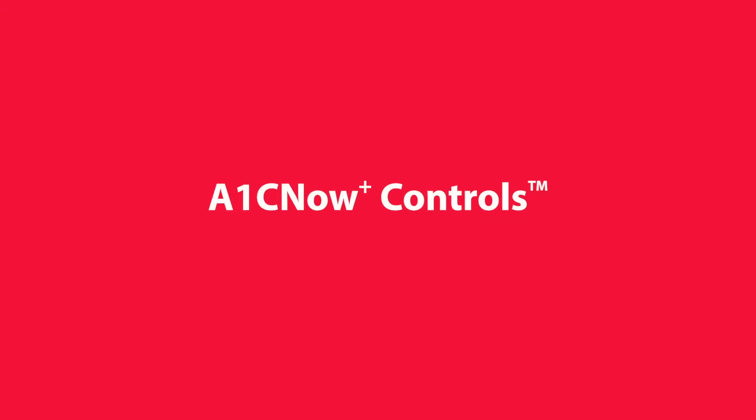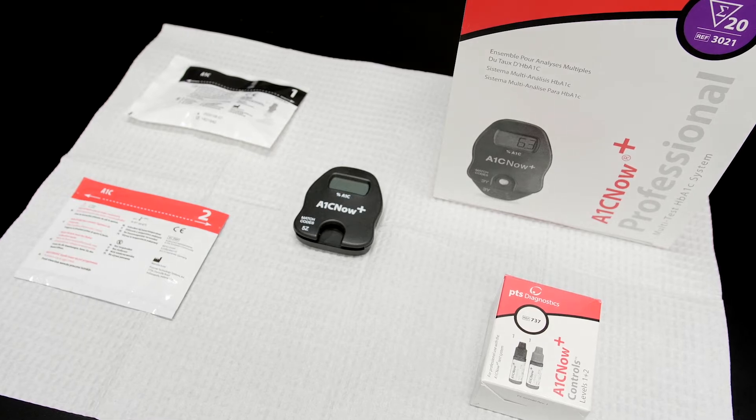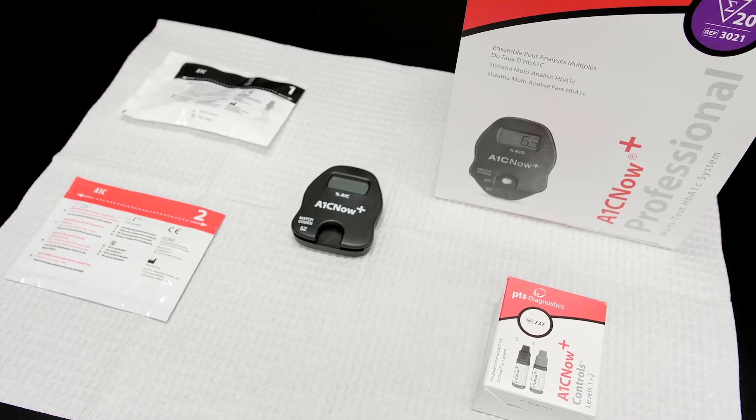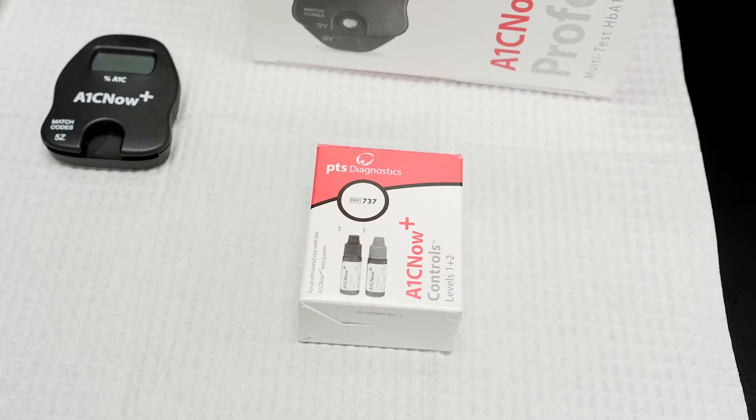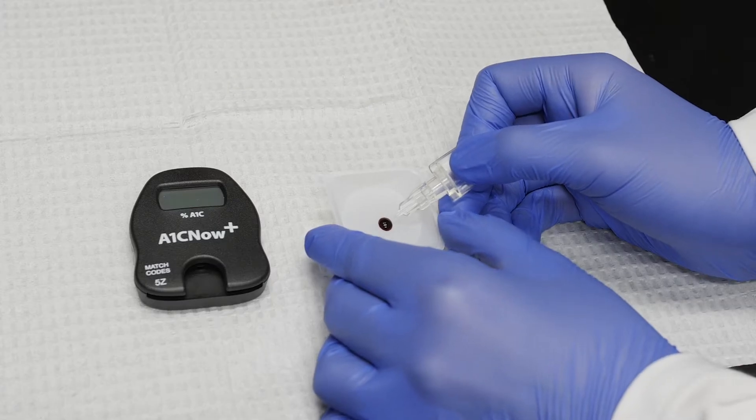A1C Now Plus Controls. Running quality control materials helps to verify the performance of the test. In this short video, we will show you the steps to run A1C Now Plus Controls for your A1C Now Plus Test System.